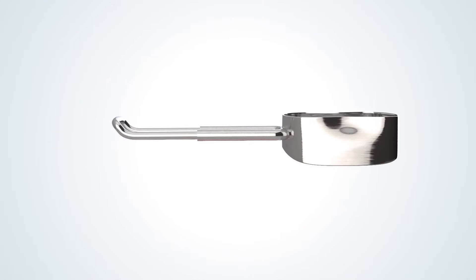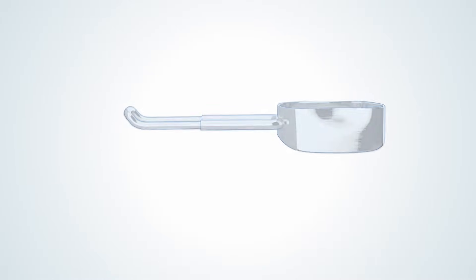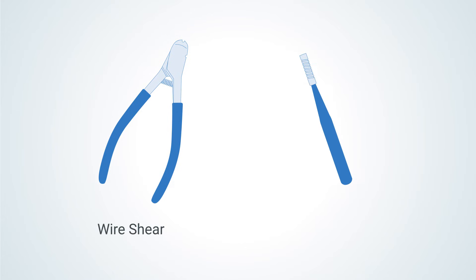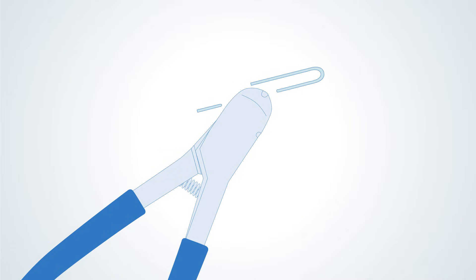Insert the chosen wire into the tubes and reseat to test length. The wires are designed to be longer than needed to make sizing flexible. But don't worry, trimming is an easy process. If trimming is required, use the DeNovo wire shear or a handpiece with a diamond bur. Make sure to leave as much wire as possible — wires that reach farther into the tubes make for a stronger appliance.